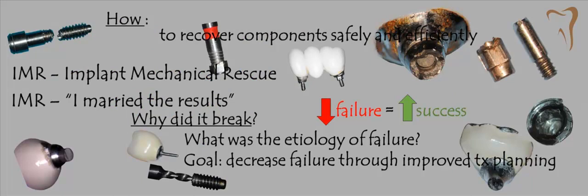If you look at occlusion and the mechanical steady state, and that's what we're really talking about, a mechanical steady state and how things might break. The question is, this is not it. These are all components that came into my practice, fractured and have been retrieved, through what Dr. Goodacre said is IMR, implant mechanical rescue. If they break in your practice, it's an emergency, and if they're coming into mine, we have control of the situation. We understand what's going on, so it's a little different, a set of parameters for us.